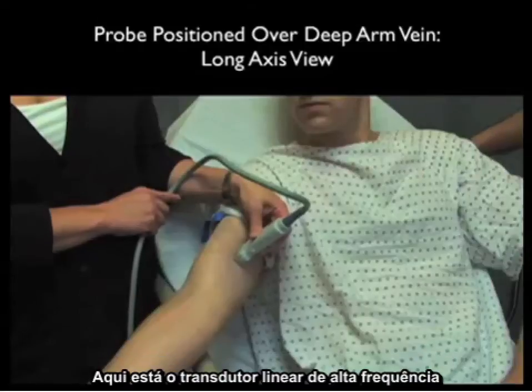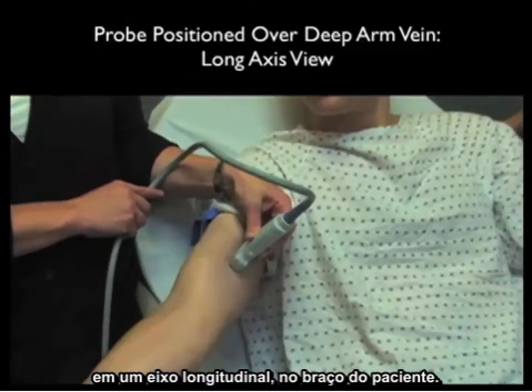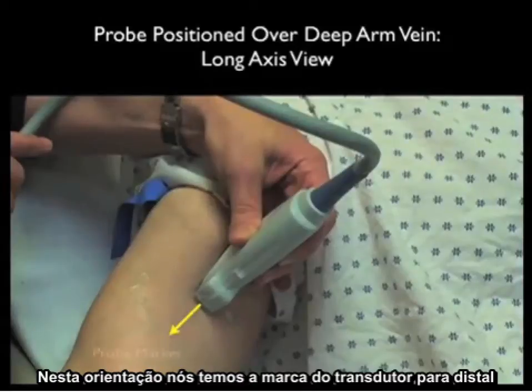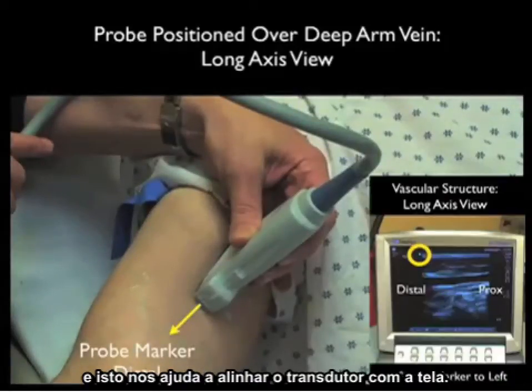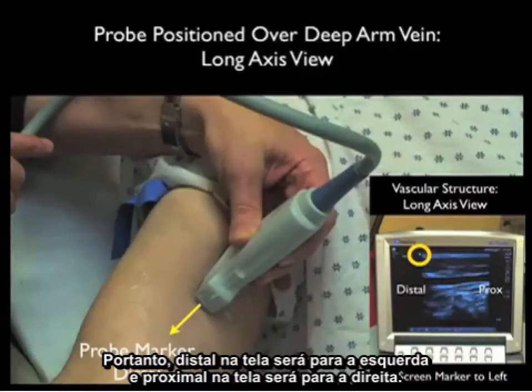Here's the high-frequency linear array probe in a longitudinal or long axis orientation over the patient's upper arm, located over the more medial basilic vein. In this orientation, the probe marker is directed distally, and this helps us line up the probe with regard to the screen. The screen indicator dot is located towards the left, so distal on the screen is to the left and proximal is to the right.